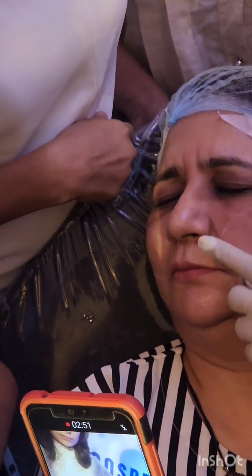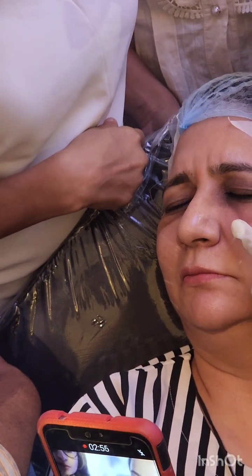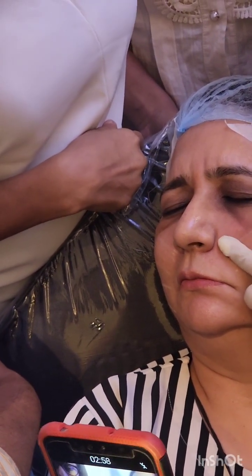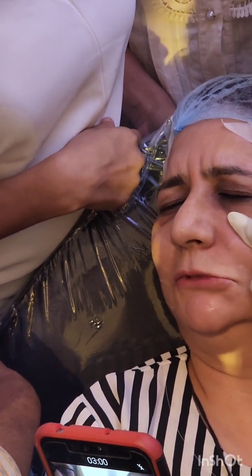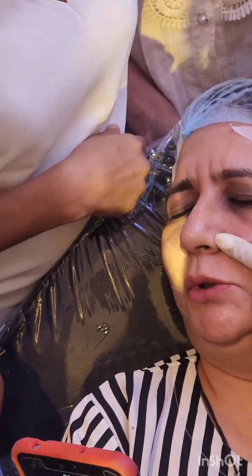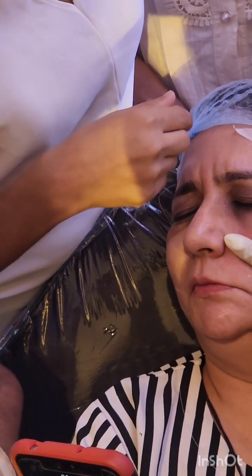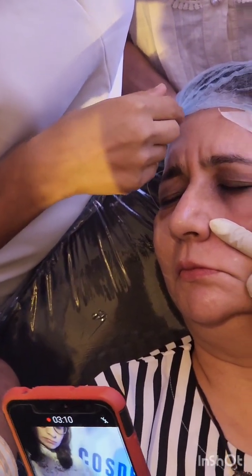Okay, ma'am. I'll do. This is superficial. Can you see the dimpling? So pull back a little. That's why she was getting pain. Now, done, ma'am. One rotation, come on. Maybe you need one more. Pull it.